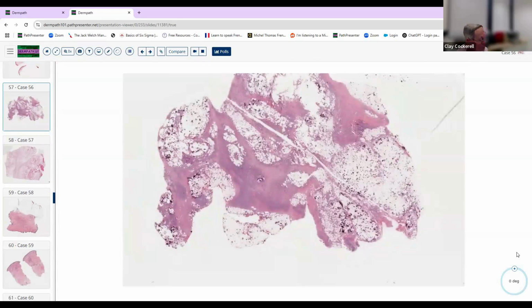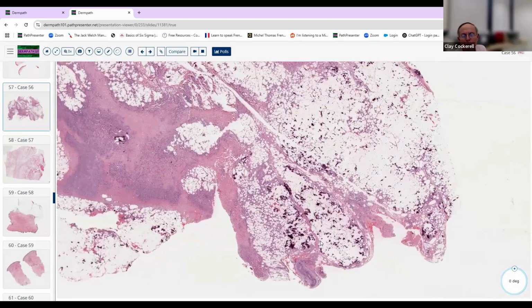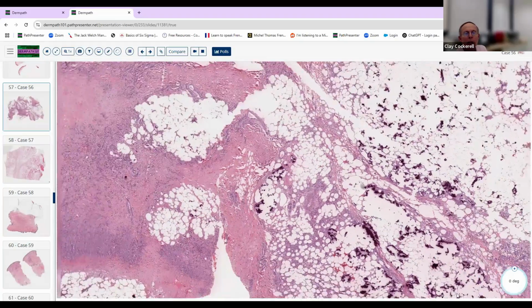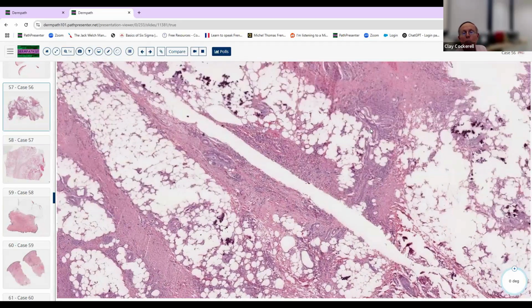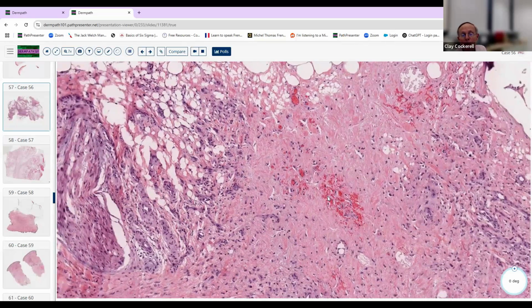Okay, 56. Here we've got a deep incisional biopsy. And notice that there's all this calcification of the subcutaneous fat here with all this inflammation surrounding it. This is small, fine, stippled calcification of the fat, stippling with this inflammation. And maybe if we look carefully above here, we might even see some thrombosed blood vessels here. And if they're going to show you this on the board, they're probably going to show you some epidermis with necrosis. And here we do probably have some thrombosed blood vessels up in this area.